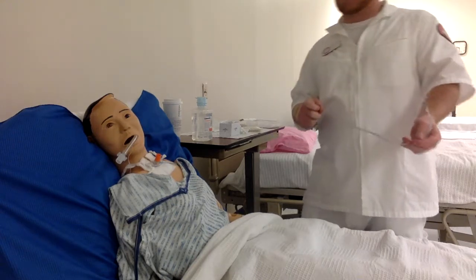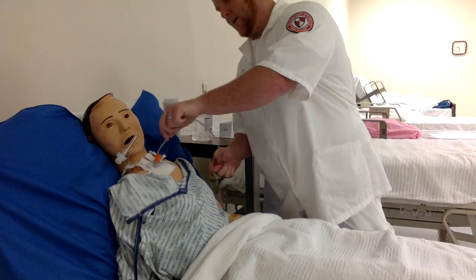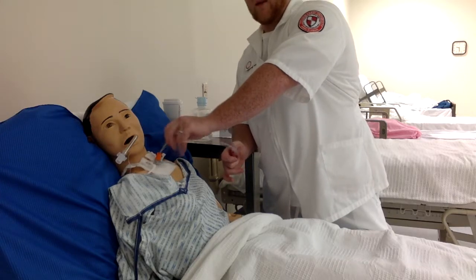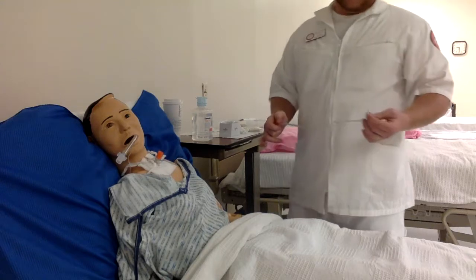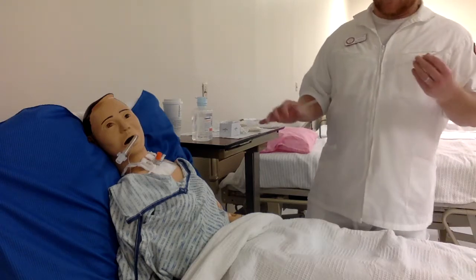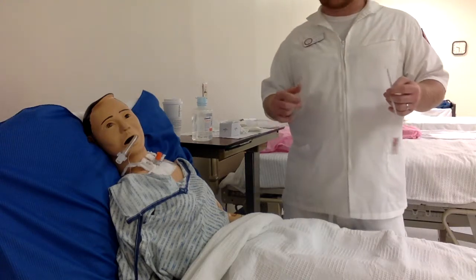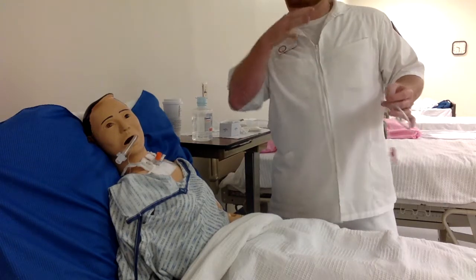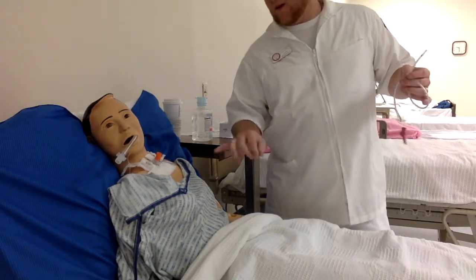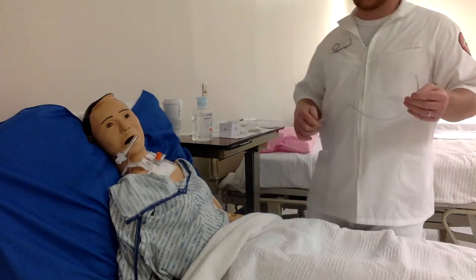You're going to push the catheter in until the patient begins to gag, then pulsate and twist coming out. Make sure the patient takes deep breaths and tries to cough in between suctions. At that time, keep your stethoscope around your neck. Take your clean hand, place it on your ears, and listen while telling the patient to deep breathe. You're listening for any remaining mucus or anything that needs to come up.